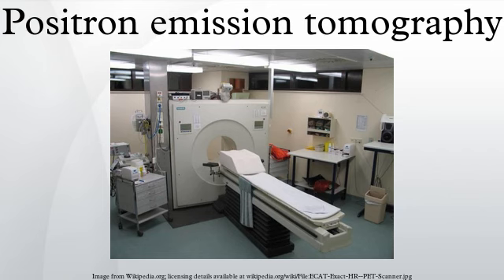Also, FBP treats the data deterministically. It does not account for the inherent randomness associated with PET data, thus requiring all the pre-reconstruction corrections described above.